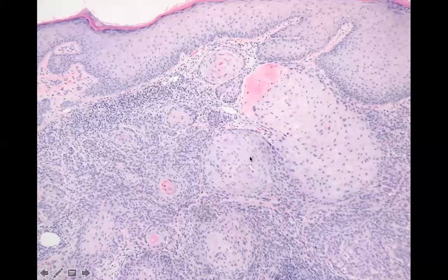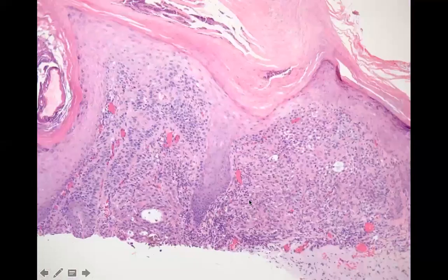Here you have your atypical keratinocytes, right? Your nuclei are too big, your cytoplasm is too much, and it's down in the dermis. And look, you don't have to go up through squamous cell carcinoma in situ to come down. Often you can be atypical here and then just drop down. That's kind of the normal pattern for sun-induced squamous cell carcinomas. Here, you're going from exactly what I just said. The atypia is on the bottom layer, kind of like AK, and then it's dropping. And you can see in here these aggregates of atypical keratinocytes throughout the dermis.